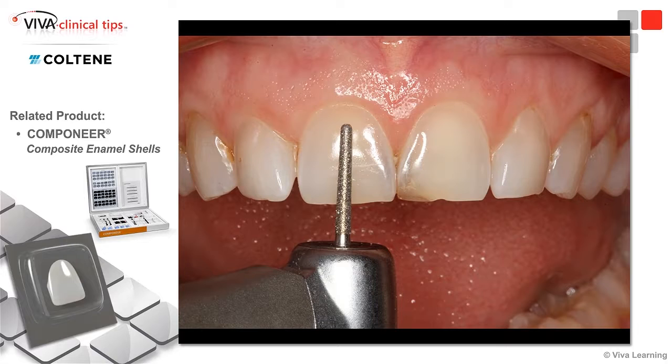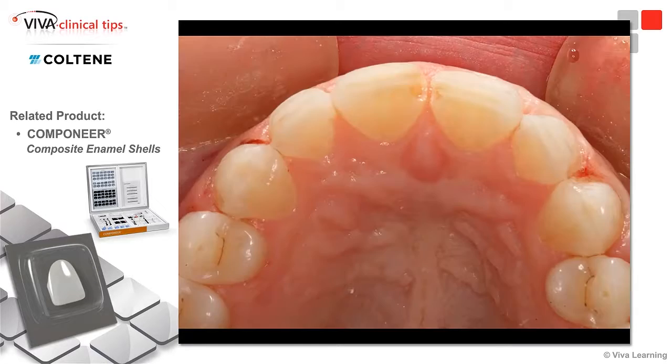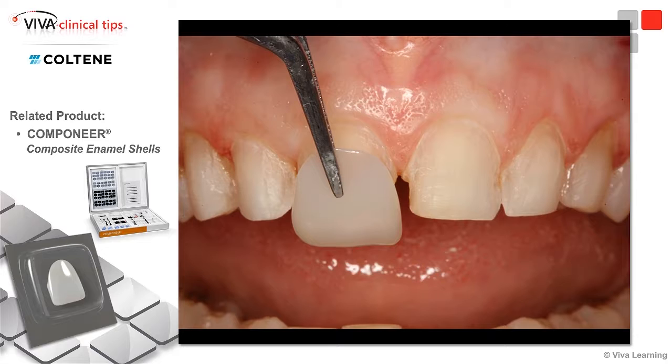All right. Anyway, so here's the preparation, about 3/10 in the middle, and then it just feathers out to the edge. So this particular patient has some class 3s and class 4 areas that needed to be filled in also, and you can see those have been prepared also. So after you prepare the teeth, then we are going to choose our size. Of course, we've already chosen the large here, and then we're going to try in the COMPONEERs.